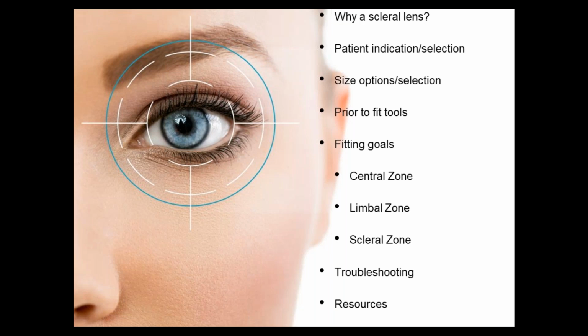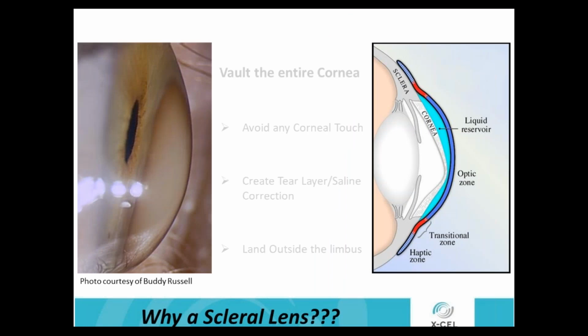What I would say when you're starting out is the first few patients and selecting those first few, just keep it really simple. Try to get the slam dunks to get your feet wet, to really get those easy fits in first, and then move on from there. So we'll do some basics.